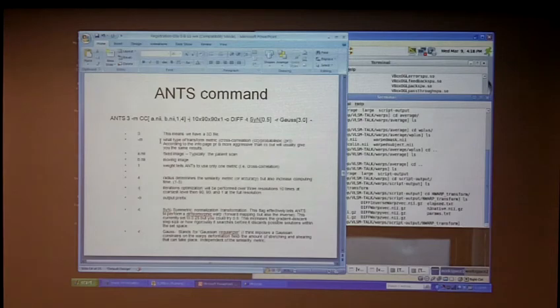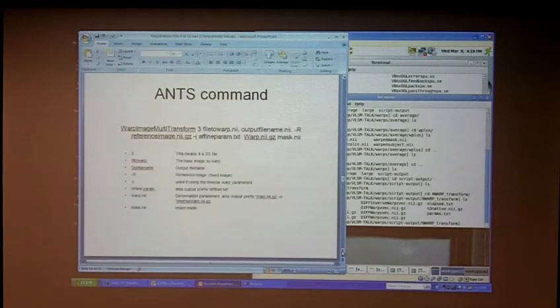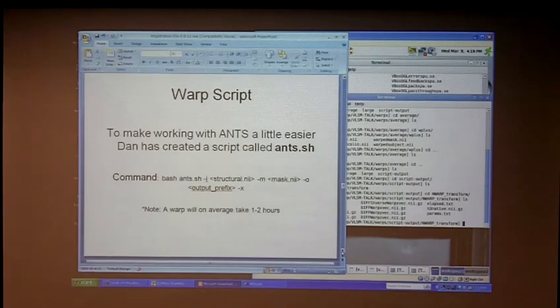Is there an advantage in doing it that way, instead of running statistics and everything on the intermediate template? I don't want to nitpick. It hardly matters at all because it's the same transformation applied to everyone. You're not really losing any more data from doing two transformations than one, because the transformations are composited. So it's really only one resampling. It doesn't much matter.